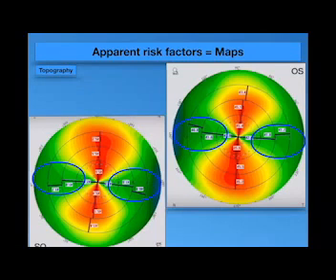So we have to measure now the difference between the superior point and the inferior point in the central 6 millimeter of the cornea. You will find here that the superior point is 45.1, and at the same level, at the same circle, you will find the inferior point is 45.5. The difference is 0.4, just 0.4 difference between the superior and the inferior point, which is more in the inferior than the superior.